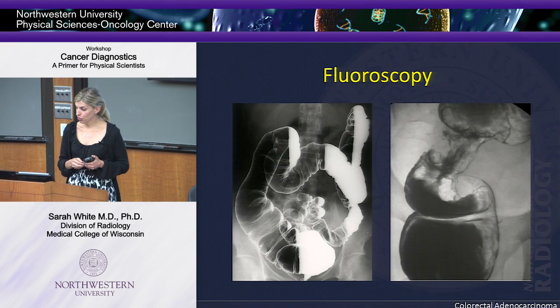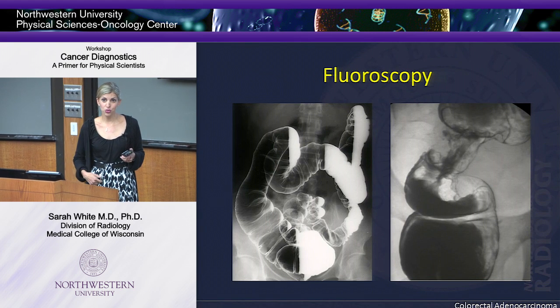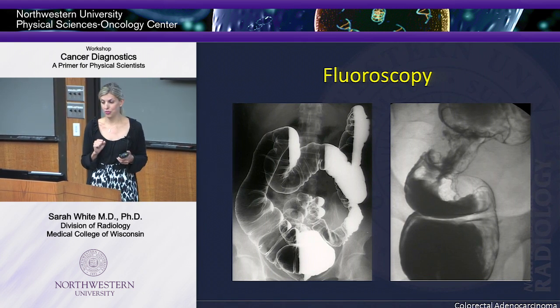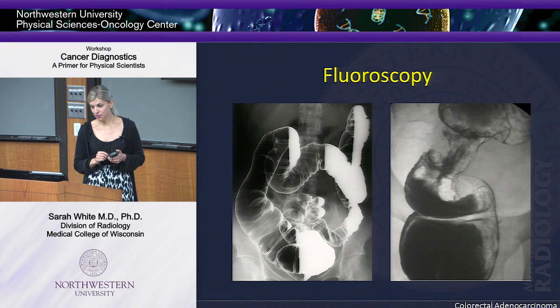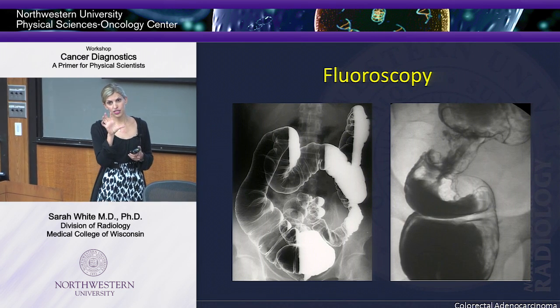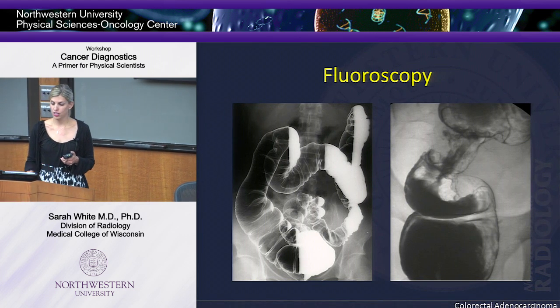And so what we do for fluoroscopy is we do barium enema. We image the bowel. So what we'll do is we'll have people drink barium. Okay, you can see barium on X-ray. And then what we do is we call it a double contrast study. We give them air. So we infuse barium in, and we do this from behind, and then we infuse air in, and you can see the double contrast, the air mixed with the barium. This is an apple core lesion right here.